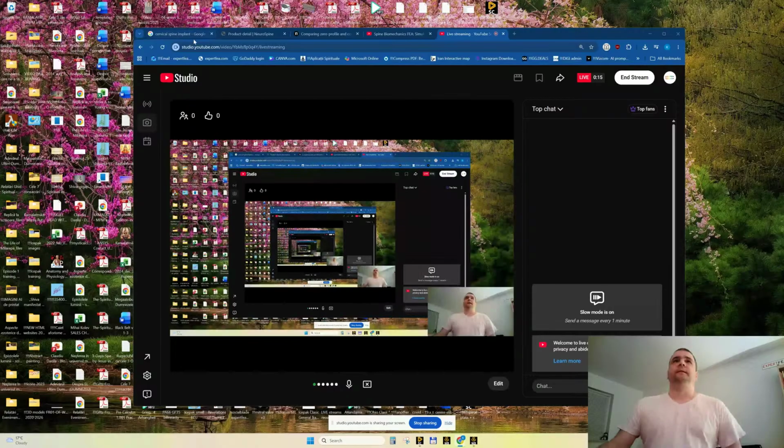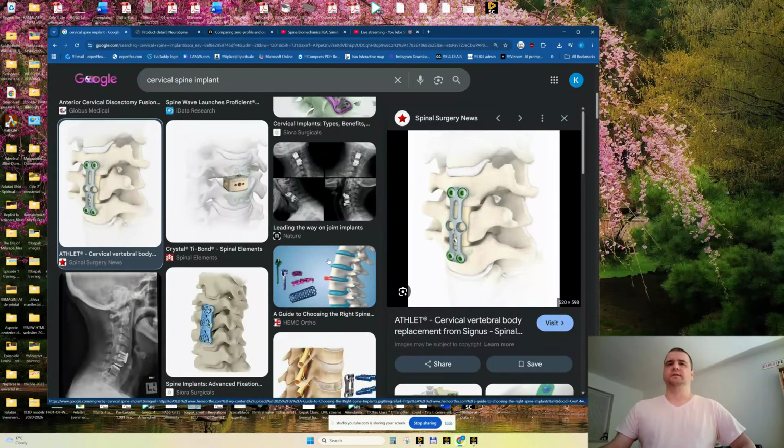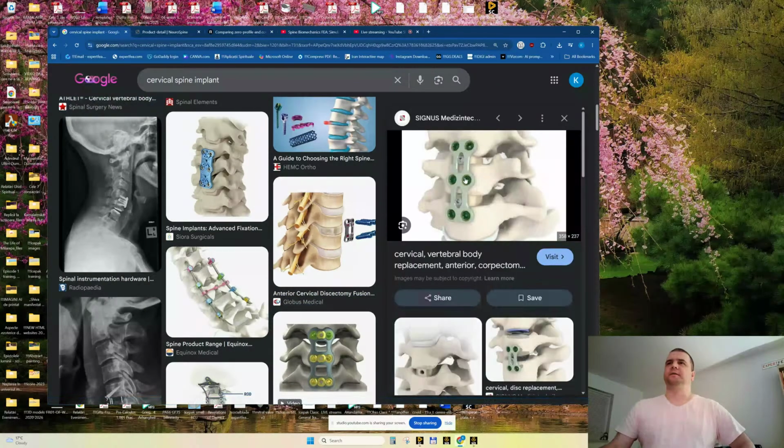Let me share my screen firstly. And I'm going to simulate something like this. So we have a plate, some screws, and also would include something like this. Spinal element called interbody cage or fusion cage. This one, okay? So let's see what we have here. Here, this looks nice.